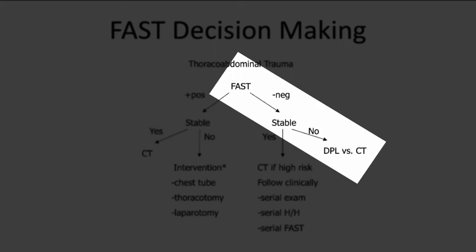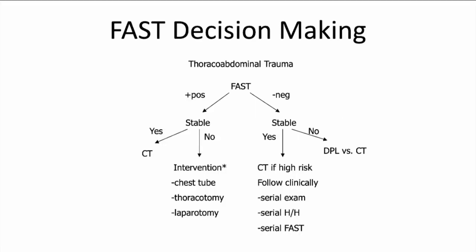If the FAST exam is negative and they're unstable, then probably what you're going to do is resuscitate and repeat the FAST in 10 or 15 minutes. Not that likely you're going to do a DPL. That is a consideration versus an accompanied CT with appropriate resuscitation measures at the ready.